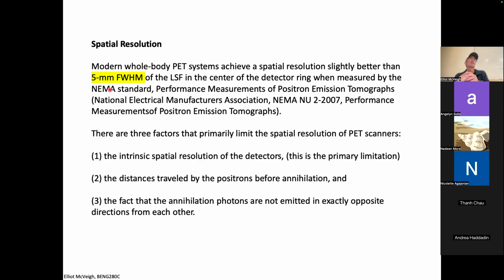So you can imagine if I wanted to do metabolic imaging of a coronary artery to find out, is it inflamed? Is there a response to some kind of hyperemia, something like that? If you're doing inflammation imaging, you basically just need a positive signal anywhere in the coronary. It doesn't have to be detailed down to which part of the coronary wall. Just a positive signal there will tell you, yeah, there's something going on in there. There's inflammation. These cells are hot, right? So you're not going to image it, but you're going to understand what's going on biochemically in there.